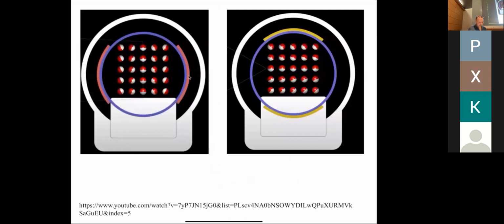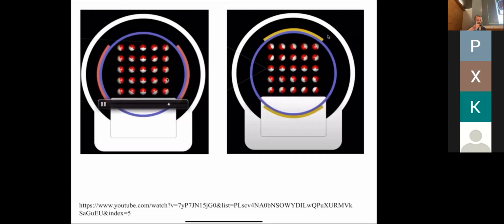Here's an example of spins, and you can see the ones at the edges are precessing much faster, and the ones in the middle aren't precessing at all. That's because we're in the rotating frame. Instead of having to keep track of everything precessing, we just say at isocenter we assume those spins don't precess in the rotating frame, because they're right on resonance. So we're only looking at the relative frequency with reference to isocenter.